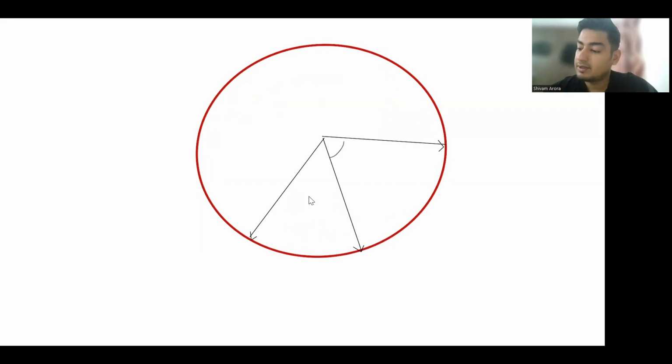And we have a 60-degree angle here and a 60-degree angle there. A lead perpendicular to lead 1 is lead AVF. A lead perpendicular to lead 2 is lead AVL. And a lead perpendicular to lead 3 is lead AVR. Clear?